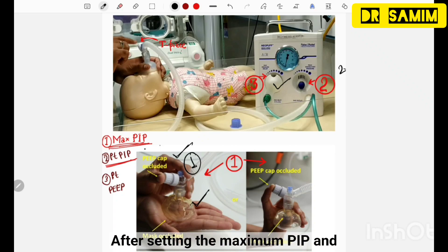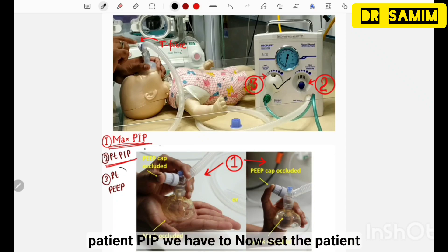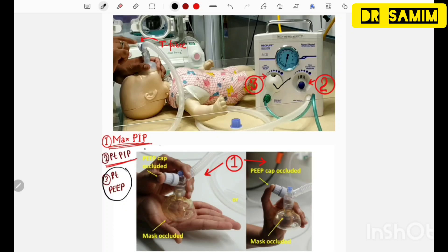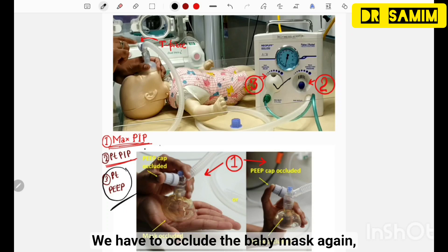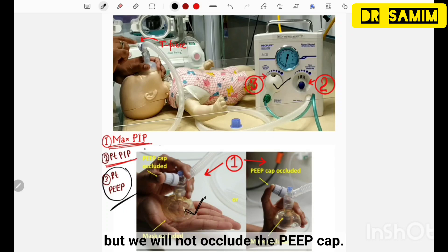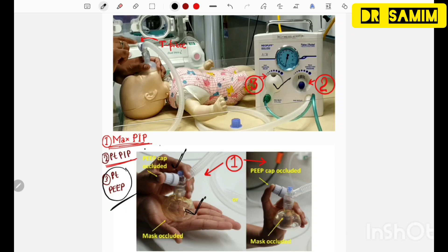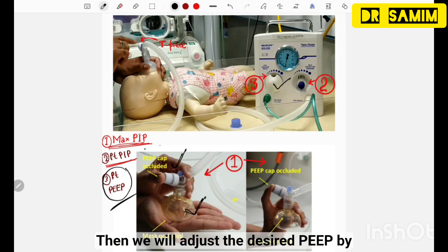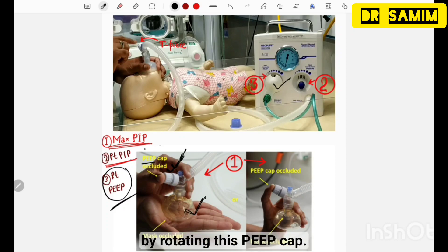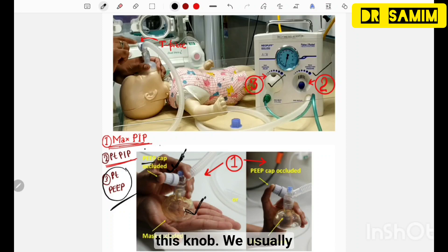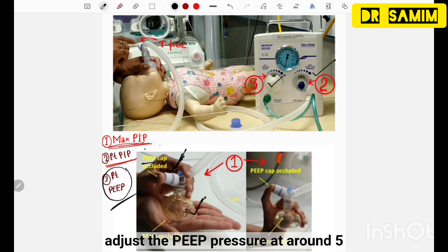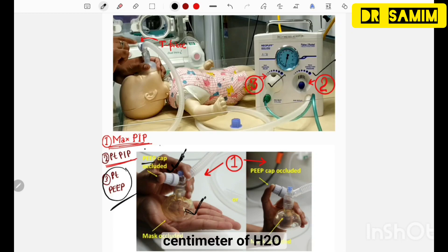After setting maximum PIP and patient PIP, we now set the patient PEEP. To set patient PEEP, first occlude the baby mask again but do not occlude the PEEP cap. Then adjust the desired PEEP by rotating the PEEP cap, without touching the PIP control knob or the pressure release knob. We usually adjust the PEEP pressure at around 5 cmH2O.